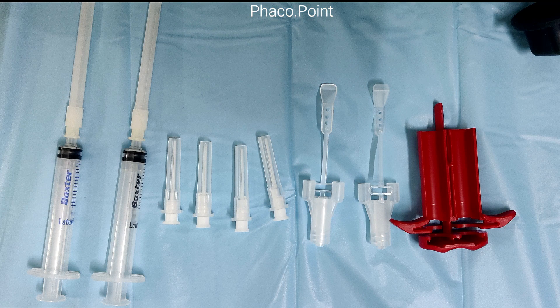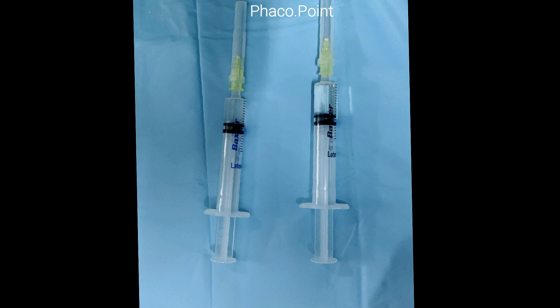At this point there are two options. Both individually drawn solutions can be housed in the Duplojet system, connected via a connector with a cannula for simultaneous injection of both components onto the scleral bed. Alternatively, each syringe can be connected to a 30-gauge needle and each component injected separately onto the scleral bed prior to placement of the graft to achieve adhesion.